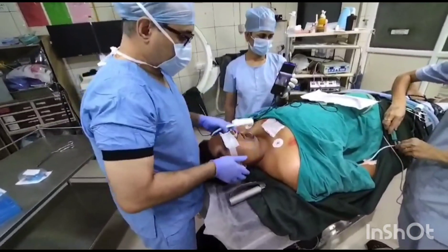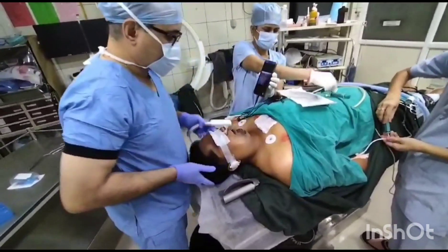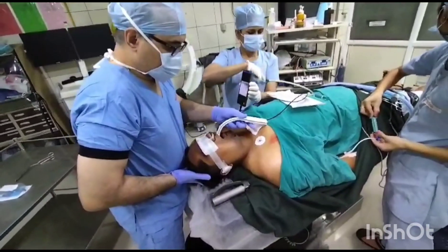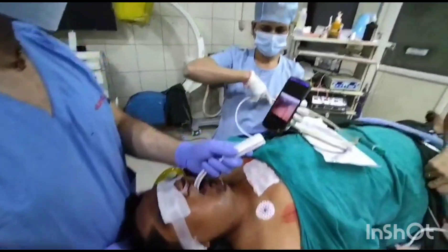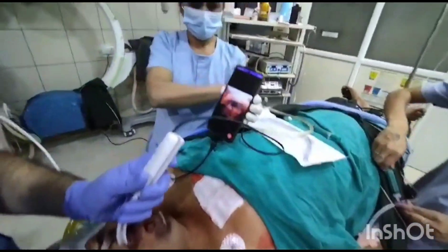I am doing a check laryngoscopy to see whether it will be possible for me with the TASCOPE to intubate or not. You can see the mouth opening. The patient is snoring. I am inserting the TASCOPE inside. This is the larynx — a beautiful view of the larynx we can see from the TASCOPE.